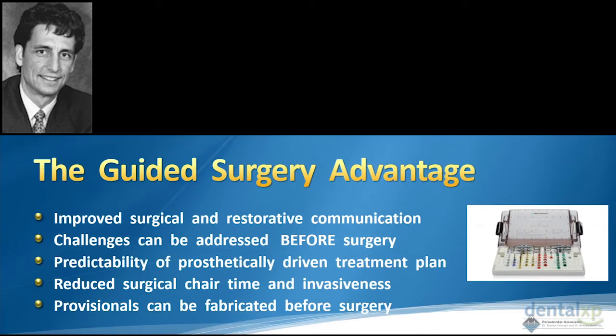So to close things out, what I'd like to do is talk a little bit about guided surgery. Guided surgery has a variety of advantages. Clearly, it improves the surgical and restorative communication. That's probably the best utilization of this, because then the person restoring can look at what is hopefully going to be the outcome, and then you guys discuss together what the limitations are going to be.